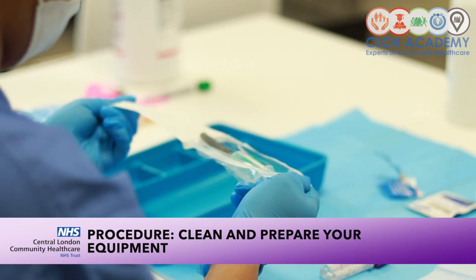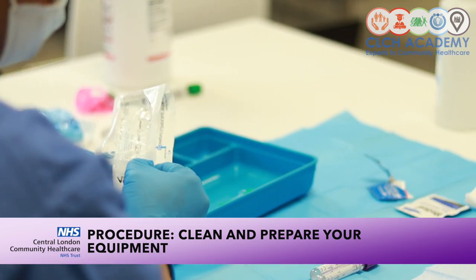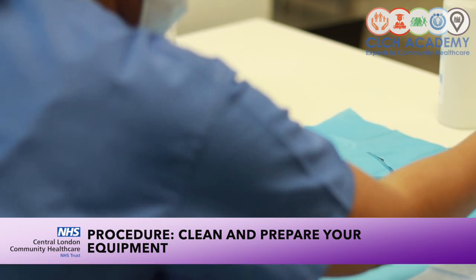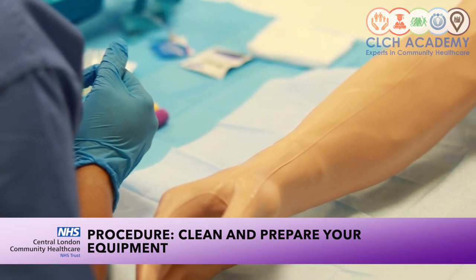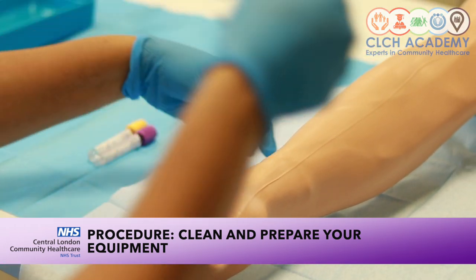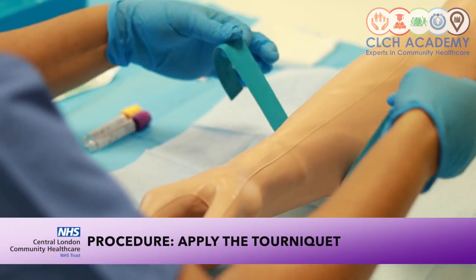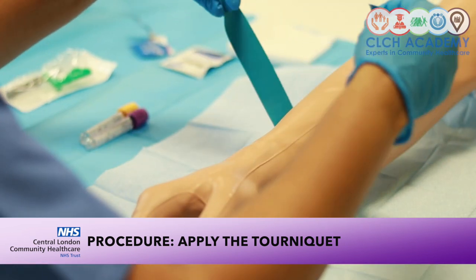Open up our equipment. Two blood bottles ready. Some gauze ready for that. Now I'm going to apply my tourniquet, aiming again for approximately 2 to 5 centimeters above the point of insertion for my needle.